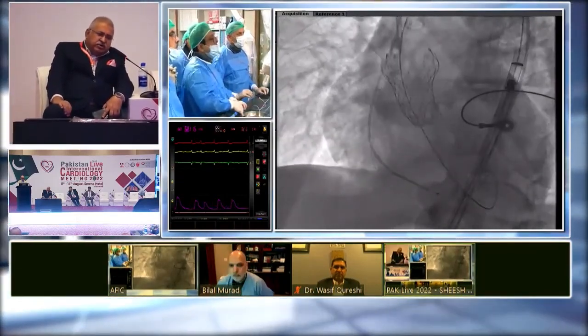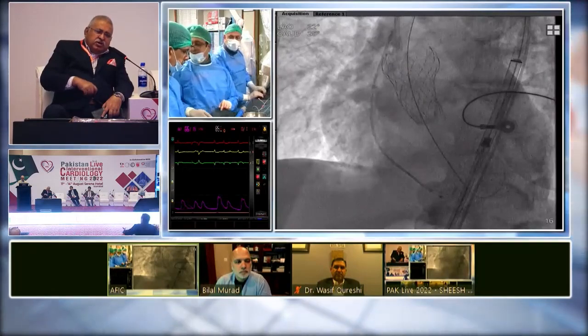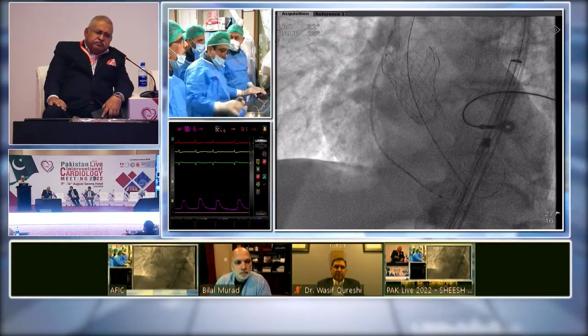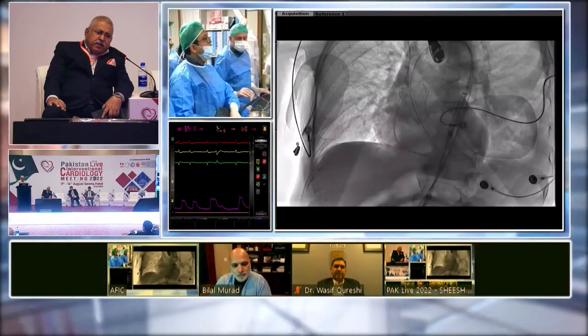As you know, there are low-risk patients and younger age groups. Let's get the sheath. Can you hear me? Yes, we can hear you.